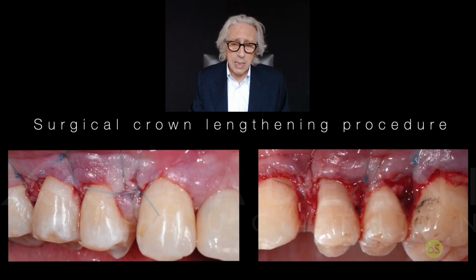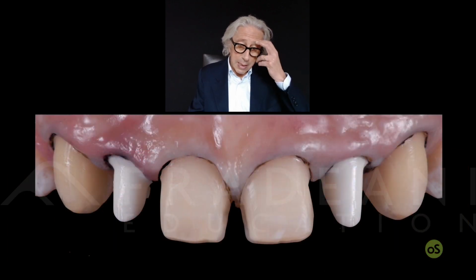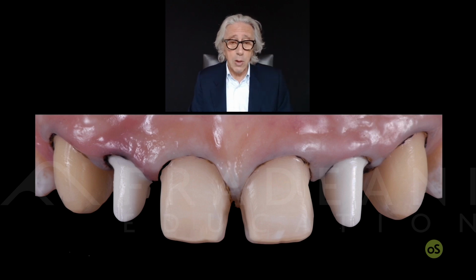As I said, we changed this altered passive eruption. We did this surgical procedure on the back side. At this point, we elongated also the bicuspid, not just the cuspid, but also the bicuspid and the molar. At the end, for the final outcome, we prepared these 4 teeth with veneers, with enamel presence 100%, and we positioned 2 implants as we said.